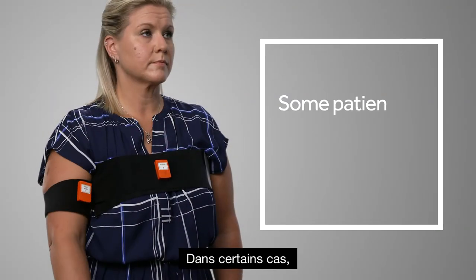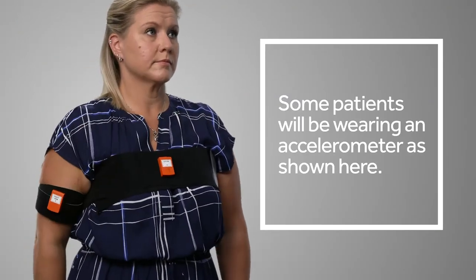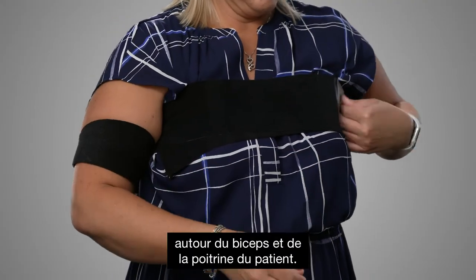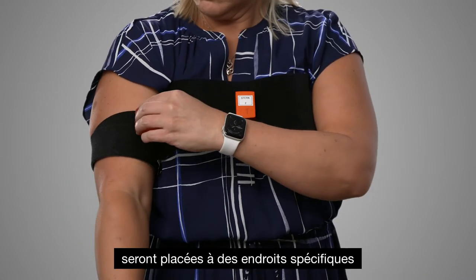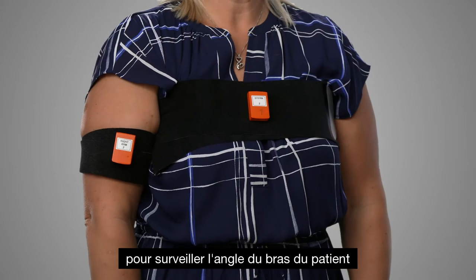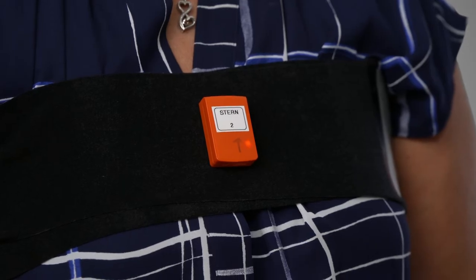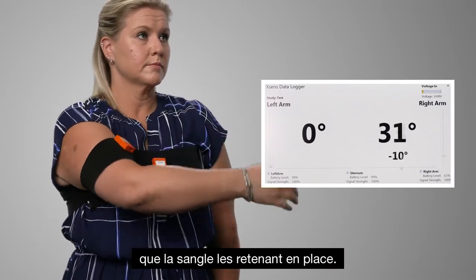In some cases the patient will be asked to wear an accelerometer. First, velcro straps will be placed around the patient's bicep and the chest. Next, two small boxes will be placed on specific locations to monitor the angle of the patient's arm compared to their chest. The patient won't feel anything other than the strap from having these in place.